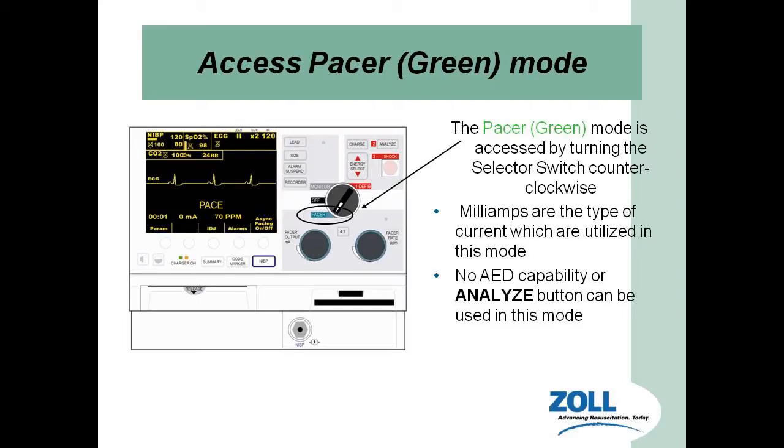We're going to be working in the pacer green mode. Everything we're working with today is in that green section. Notice that when it is in pacer mode, no AED capability or analyze button can be used in this mode. So if something happens and the patient goes into ventricular tachycardia or ventricular fibrillation, we need to switch into defibrillator mode to be able to defibrillate this patient.